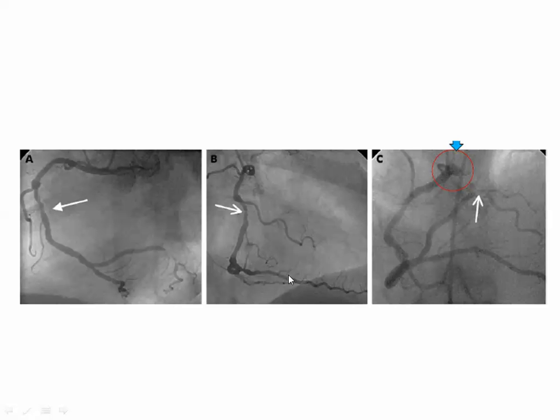What's this? Giving many septal perforators. It's a PDA. What's this wall? Septum, anterior, lateral, inferior. It is inferior, it is right dominant. Okay? And this is the PL. What's this view?